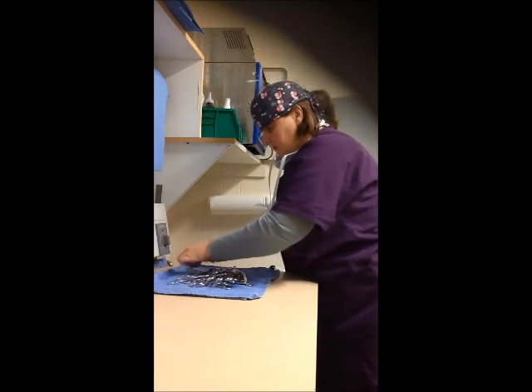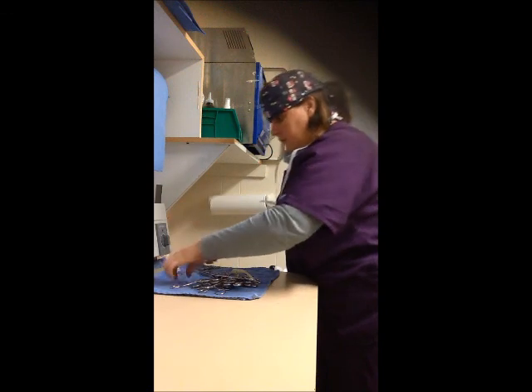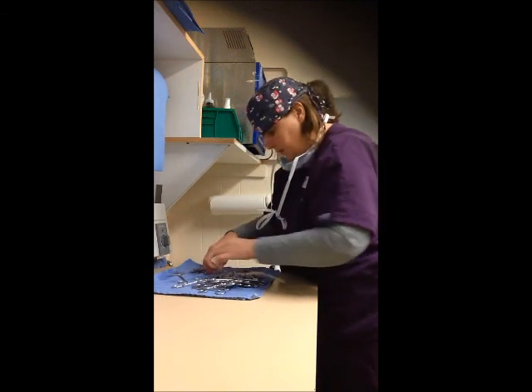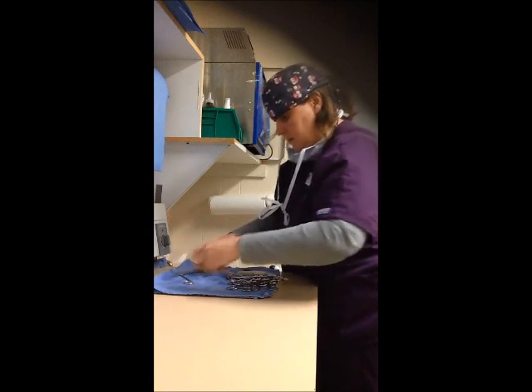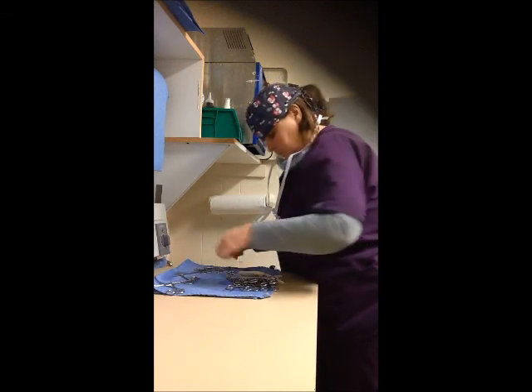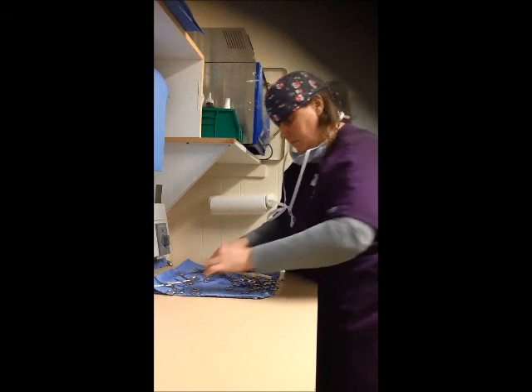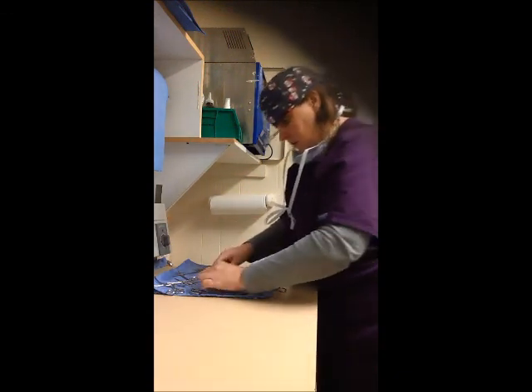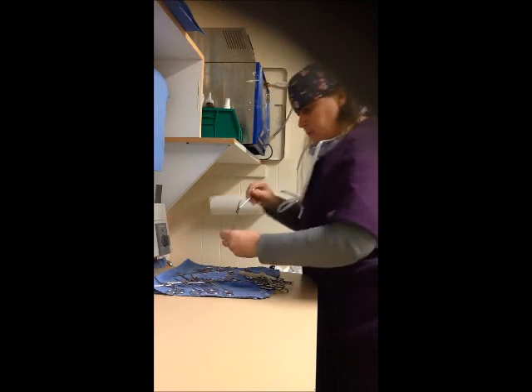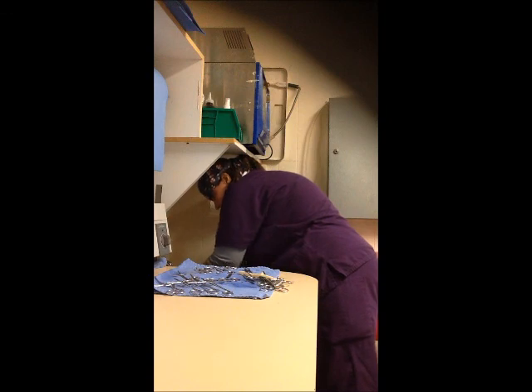Take all of our instruments and open them up. These are the towel clamps. The scissors, I make sure there's no blood or debris on anything. If there is, I scrub it off. This is for our pack wrap. This is a laceration pack. There is blood in this one, so we take our wire brush.